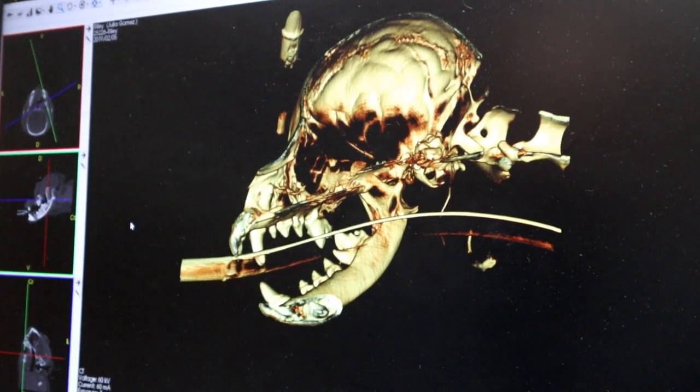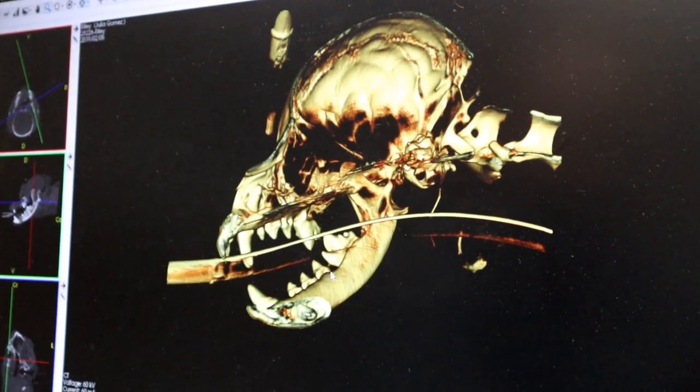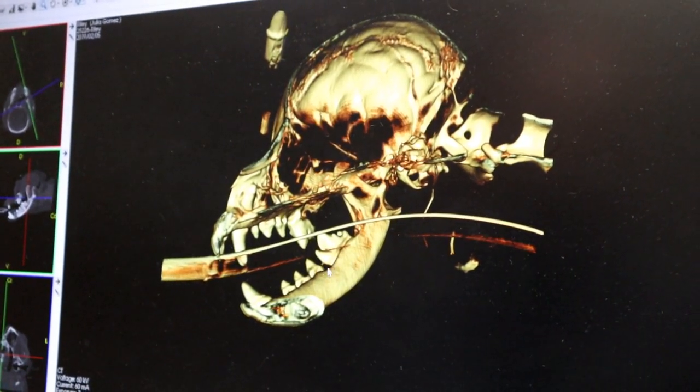I usually don't use the tissue coloring unless I'm looking for maybe a fracture — a jaw fracture you'd be able to see as a defect in the jaw. You would see it on x-ray too, but it's kind of neat to show owners when it actually looks like a real skull.